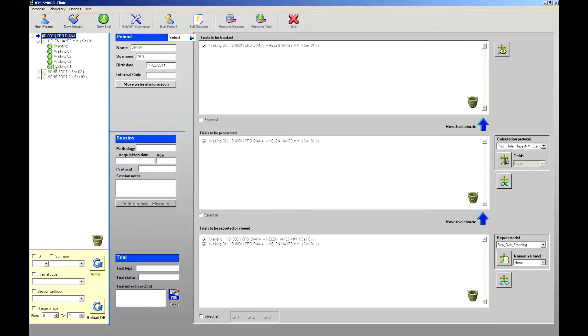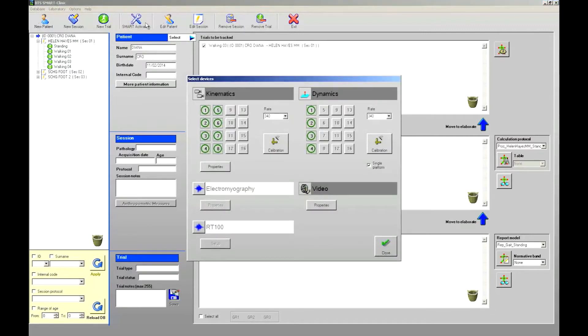The SmartClinic toolbar allows running the most common functions in a fast and easy way. As soon as the SmartBox is switched on, all the devices are automatically detected. All the basic settings and the functions required for the system preparation are available via the Activate Smart button. By clicking on the Smart Activation button, a window will open from where the different devices can be managed.